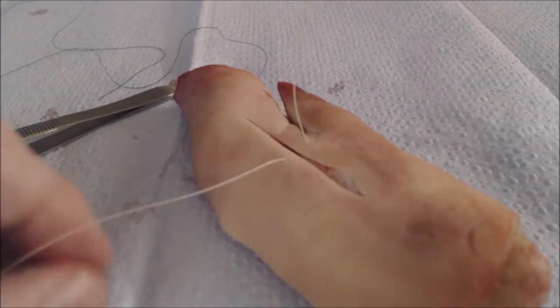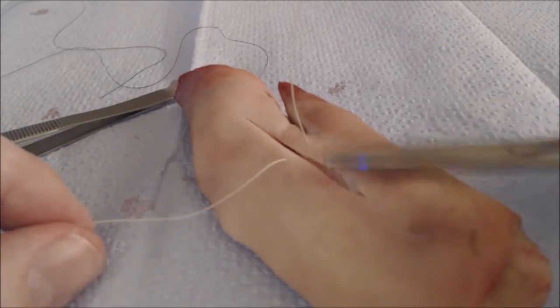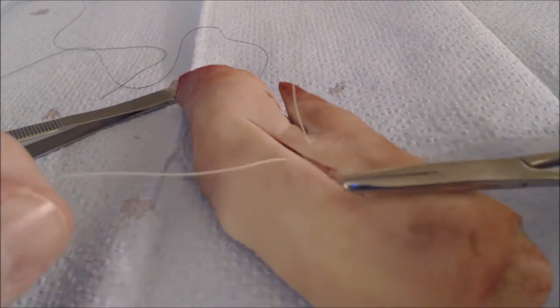You don't always need to use a two-handed tie. In fact, you don't need to spend the time learning how to do it if you have needle drivers in your instrument kit.